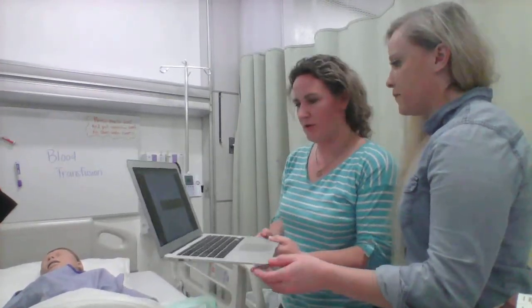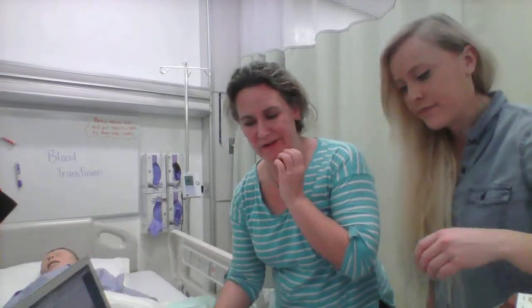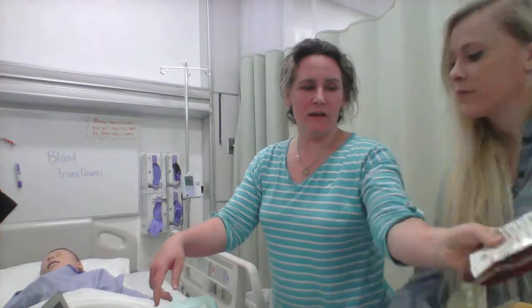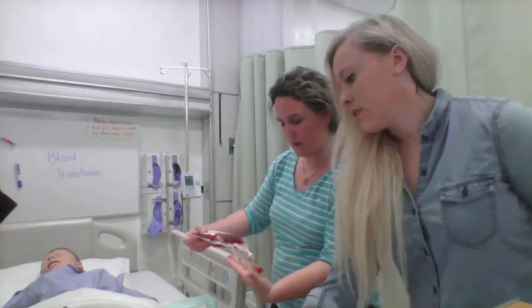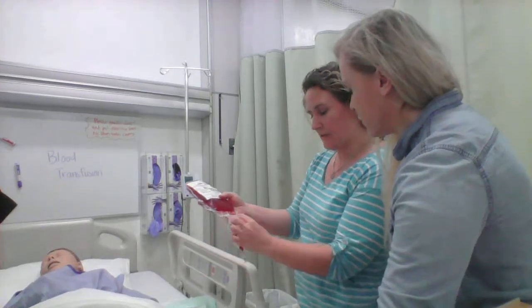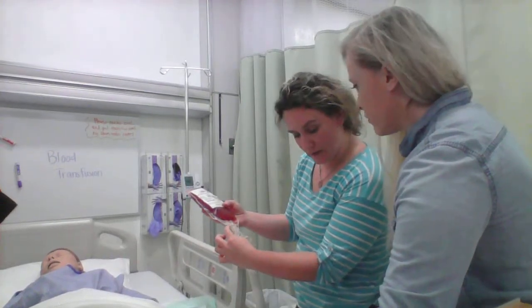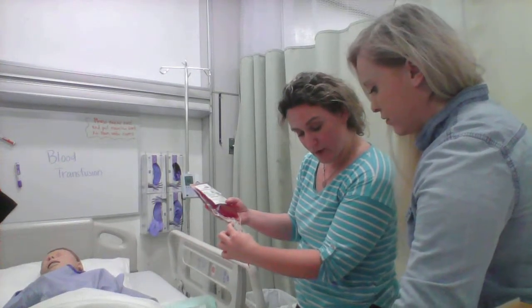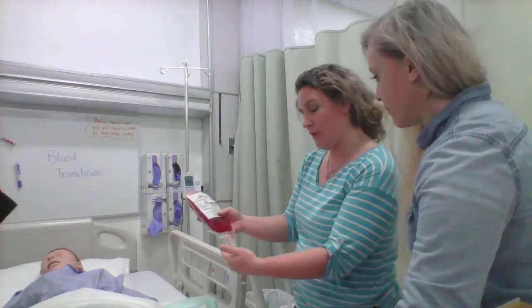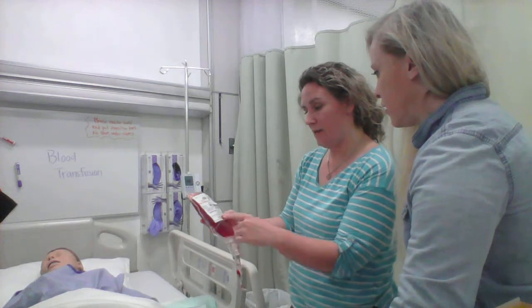Jessica, this is Robert Crowley, and I want to confirm here that we have the EHR down here. There's going to be a piece of paper off to the side, and on that piece of paper we're going to have the order number and the transfusion record number. I want you to go ahead and state that number out loud.